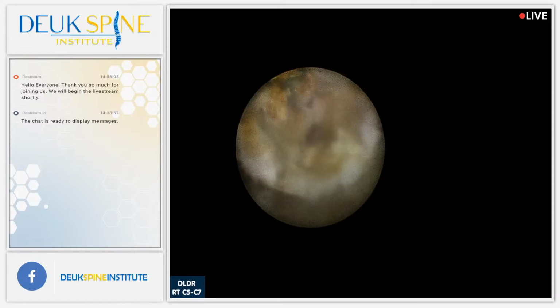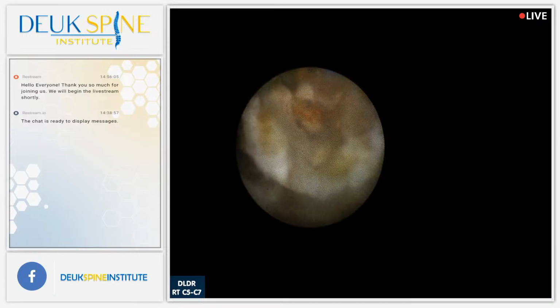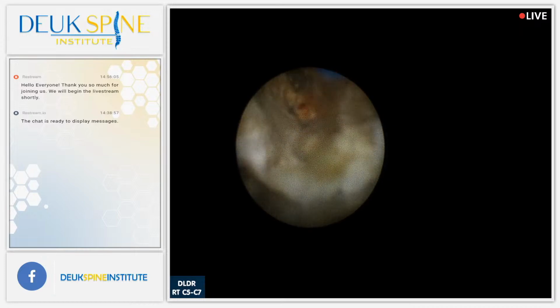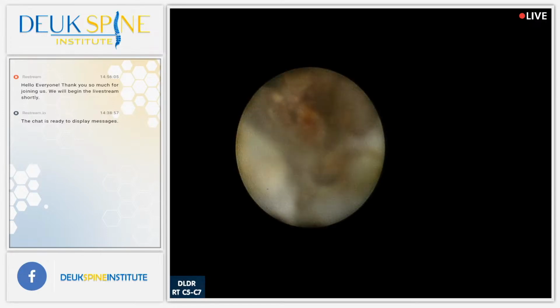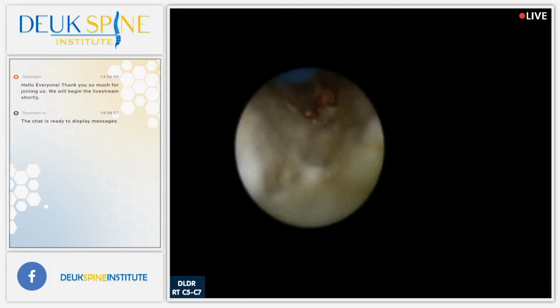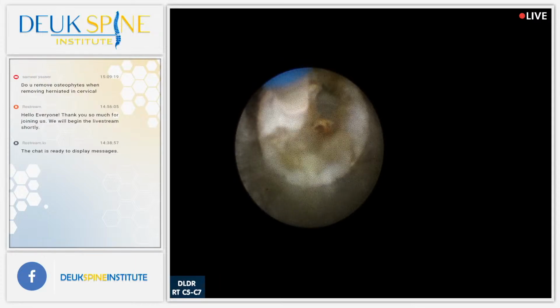This is pretty bad. People ask about bone spurs. Yeah, this is one of the most bone spur-full spines I've seen in a long time. Everything is calcifying. Doesn't mean it's fusing. Don't mistake that for fusing. It's not fusing itself. It's just calcifying.